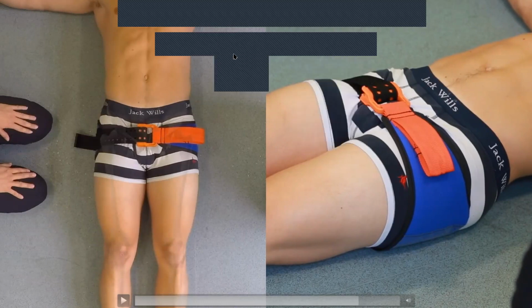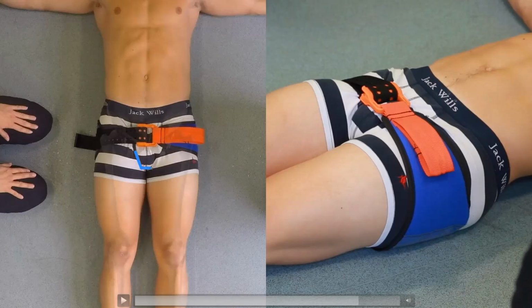All right. So what we would normally see is the scrotum just about here. Sorry, let me just get the scrotum there. And we would see the base of the penile shaft about there. So you're going just above the base of the penile shaft, more or less, let's say, even over the bottom third of the penile shaft. So that's where you'll be basically aiming for in a male patient.